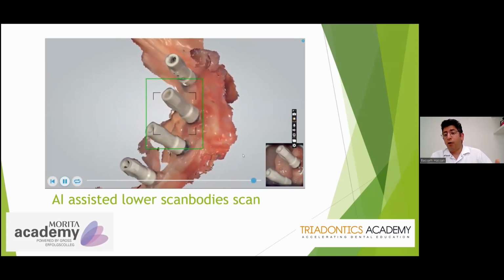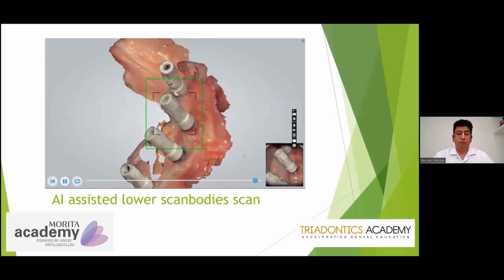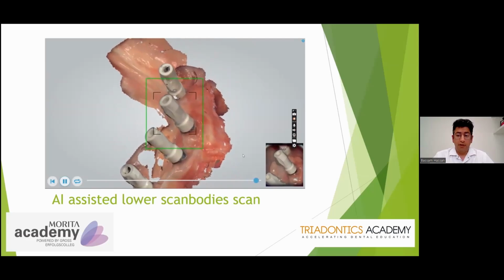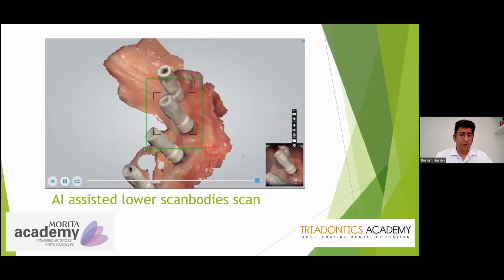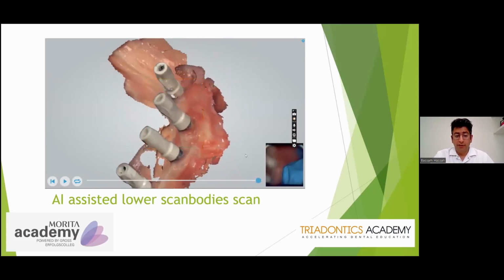So we've come a long way with edentulous jaw scans, with mobile tissue scanning, with bite registration. And that's all thanks to the recent improvements in intraoral scanning technologies.